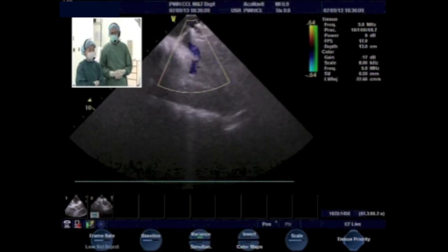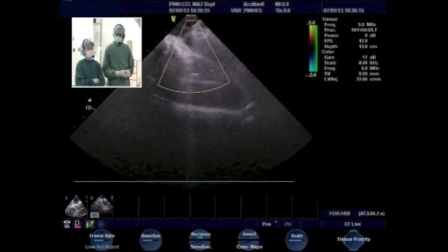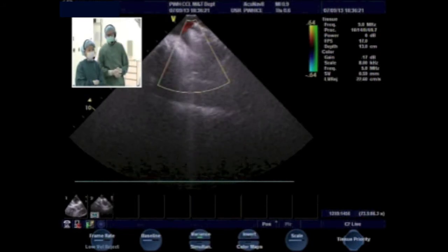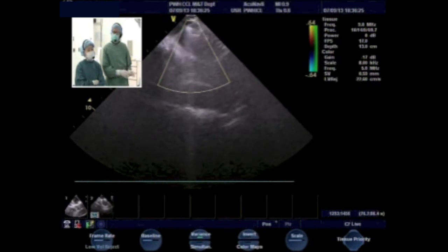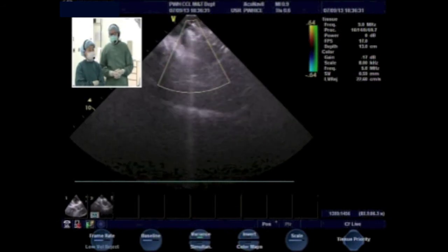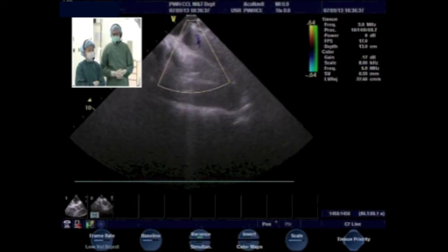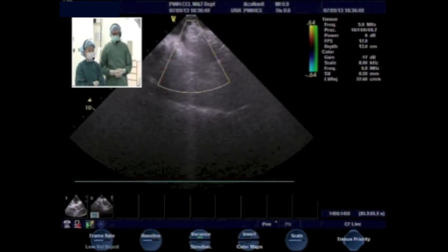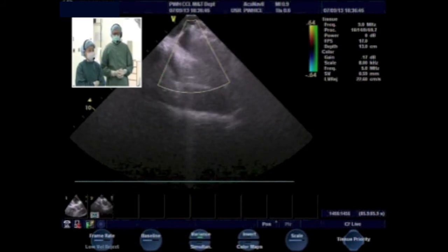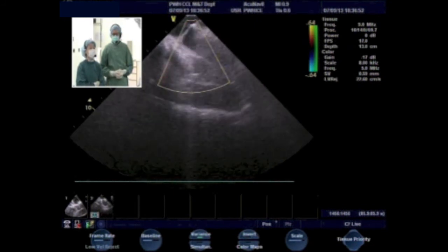Do you find that intracardiac echo sometimes has difficulty assessing the mitral valve? I think ICE is difficult if you don't have the experience in it. We have two persons in our center who are very, very skilled, and they come down and do the ICE during the procedure, and you get fantastic images, much better than I can do here as an interventionist. Any other comment? Yeah, I believe ICE is an excellent technology. You can assess everything as much as you can do with TEE. So as Lars mentioned, it depends on the operator. If you are not skilled, then you will find difficulty in assessing. But if you use it day in and day out, it's just like TEE.